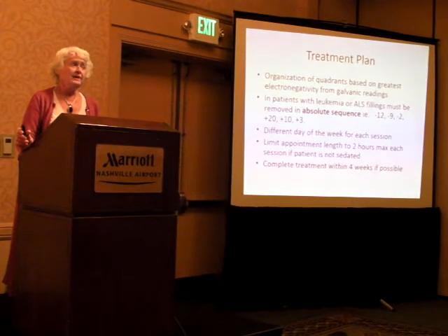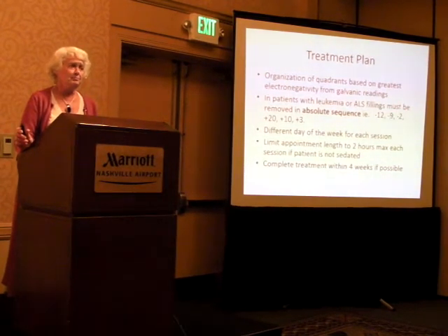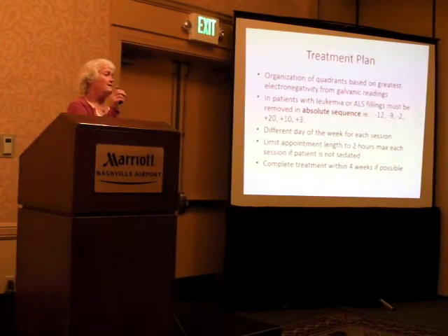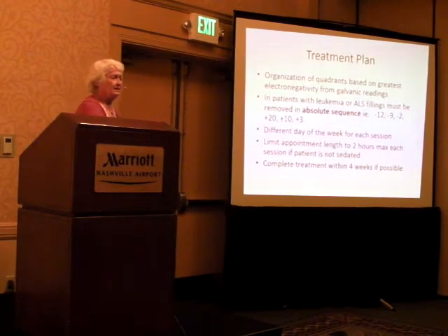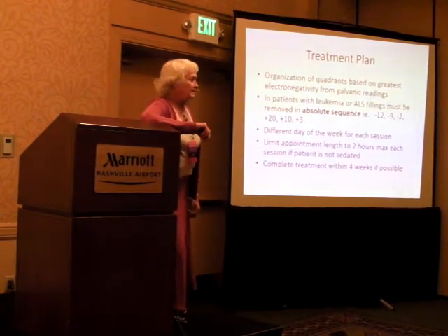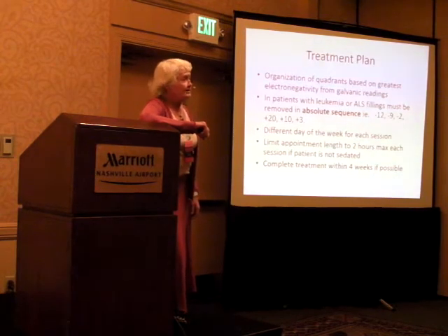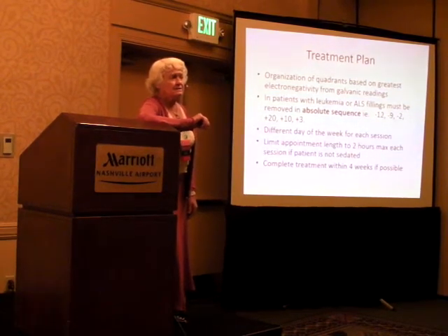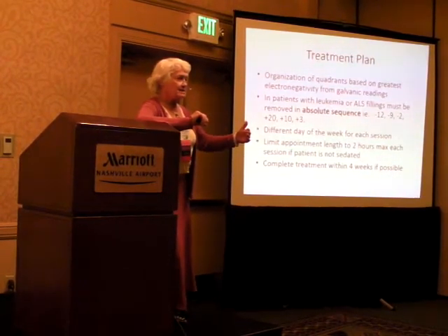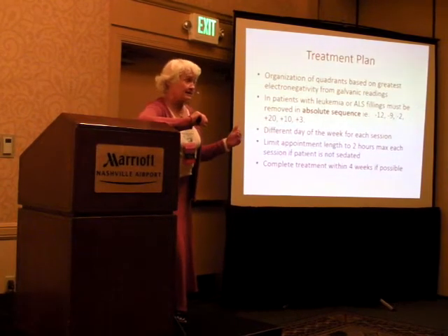It's from the teeth. It's the galvanic cell that's set up. So what we're doing is actually putting the probe right on the teeth themselves. They don't always read the same. If you have a gold crown, you can find it'll be negative or positive. The longer you do it, the more varied your readings are going to be. Sometimes I'll expect to get a certain reading, and then it just blows my mind with what I'm actually getting.